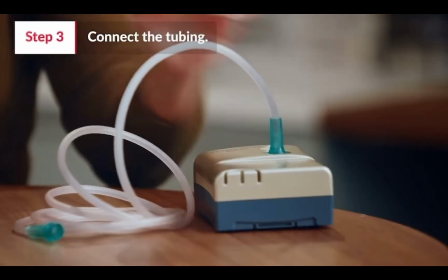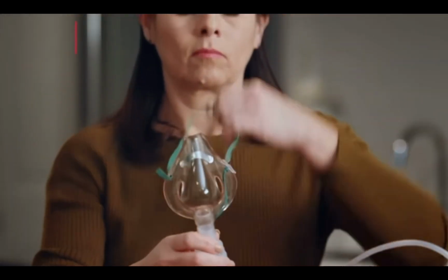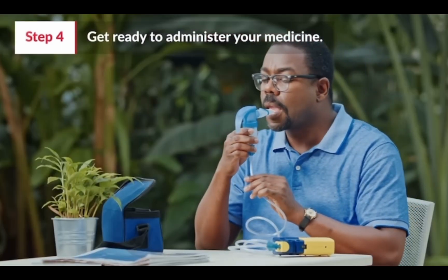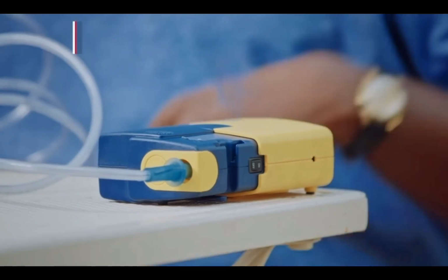Connect the tubing from the compressor to the medicine cup. Put the mask over your face or put the mouthpiece in your mouth between your teeth and close your lips tightly around it. Turn on your compressor.